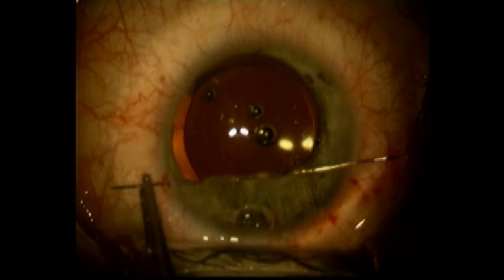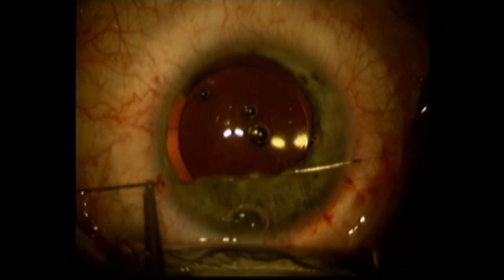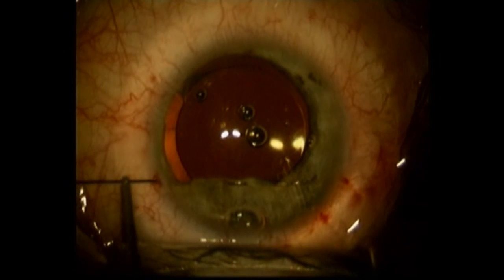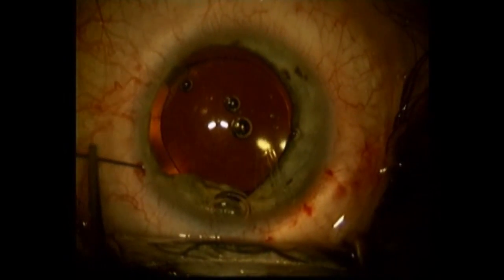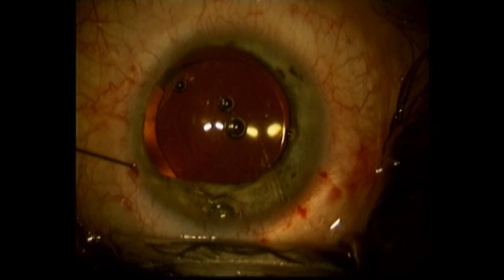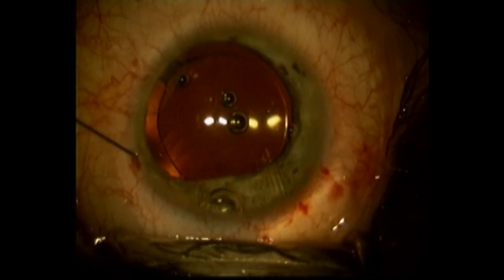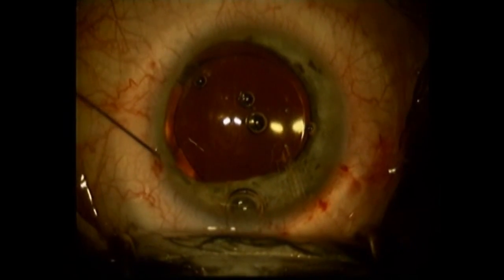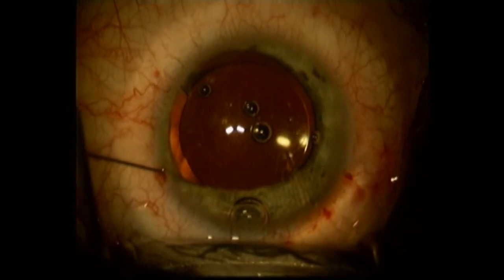I don't want to create a bleed — a hemorrhage that could very easily occur here. This patient has quite a bit of permanent mydriasis and some atrophy from long-standing mydriasis. So I want to be extremely careful here, just getting the edge of the iris, and we're going to go ahead and try to perform this purse-string effect all the way around.